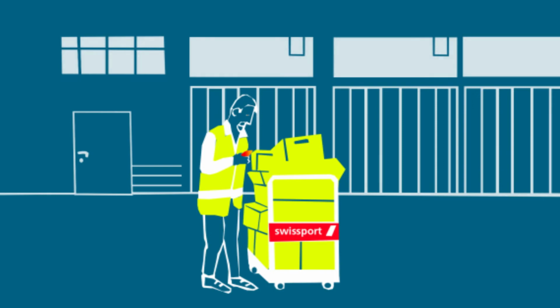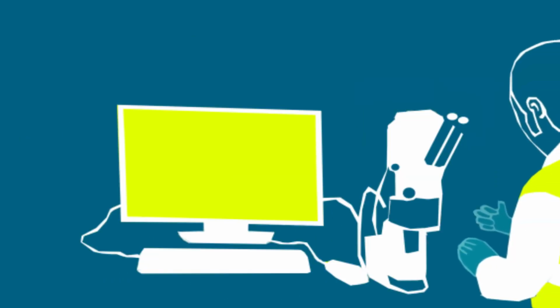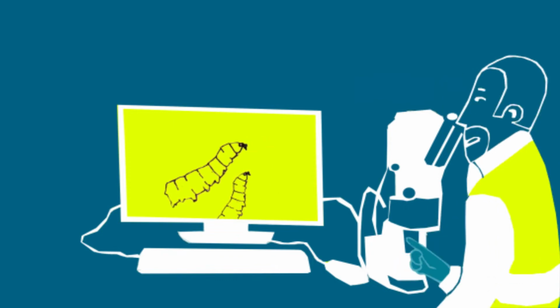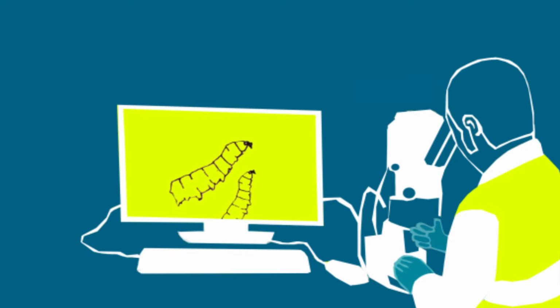On this mango, I've discovered a suspicious-looking fruit fly larva. If this turns out to be a particularly dangerous plant pest, I'll have to reject the goods. I can't identify the insect precisely through a visual inspection alone. That's because there are related fruit flies that are similar looking, but which are not regulated. In order to be able to identify the insect, it must be examined genetically.